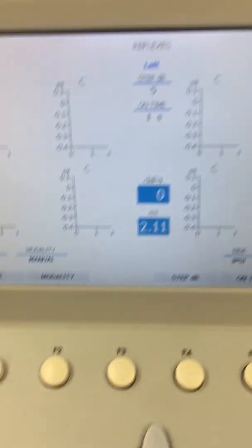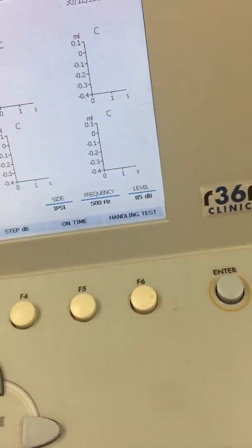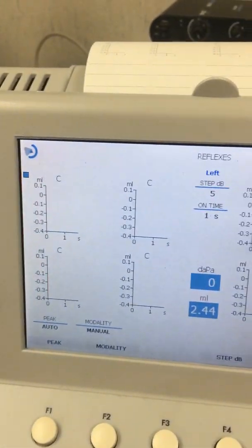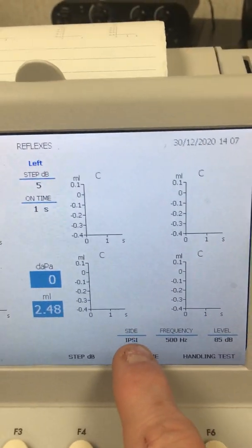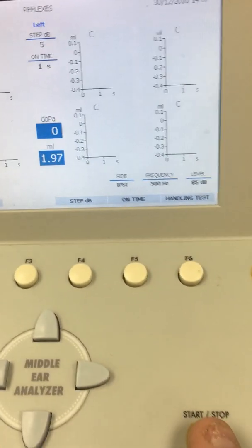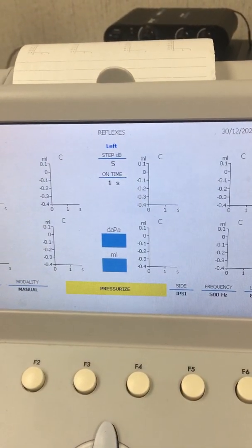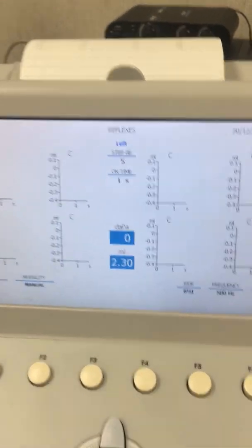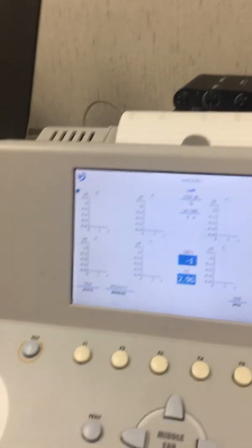Make sure that we're again on the left side. So choose your side, it's ipsy. You can look and it says ipsy, and press your start stop button here. It'll pressurize.